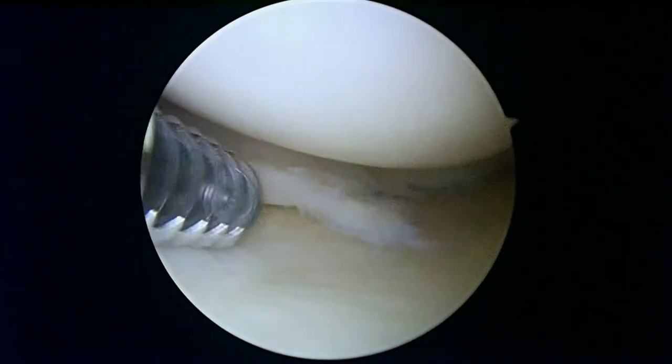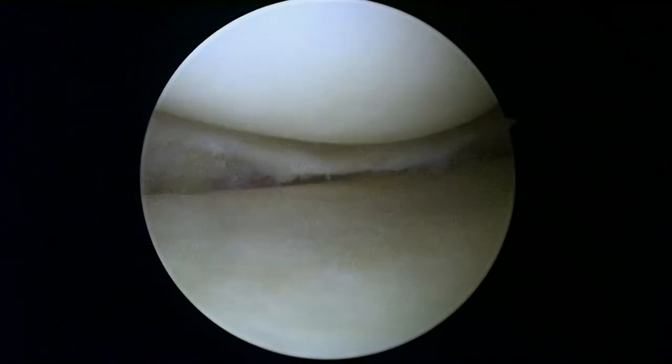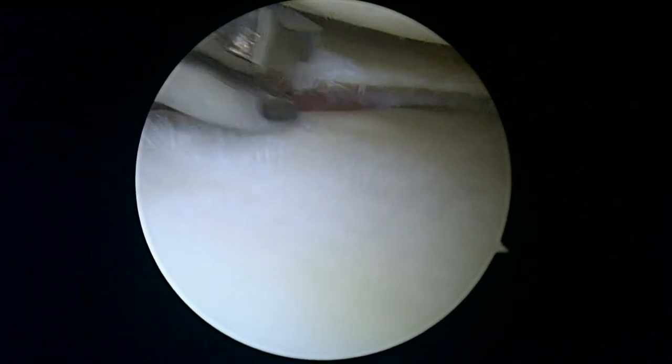There is a meniscal tear that's causing problems. See how that flap is loose and how it can move around — even with a little bit of suction you can see how unstable it is. We're going to start with our shaver, and then take a pair of scissors to work on the posterior horn a little bit. That one unstable piece is already gone, and we'll see if there's anything else back here that needs to be smoothed out or resected.